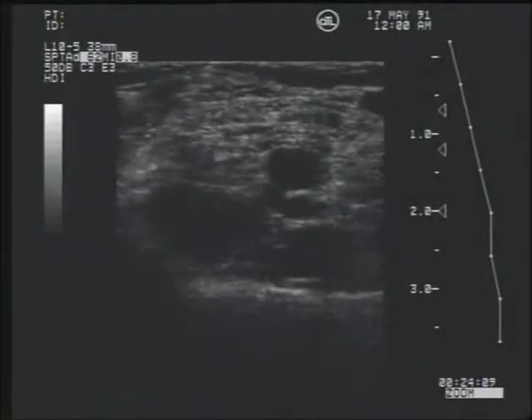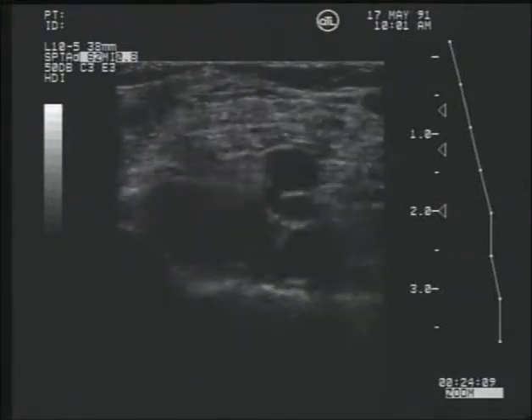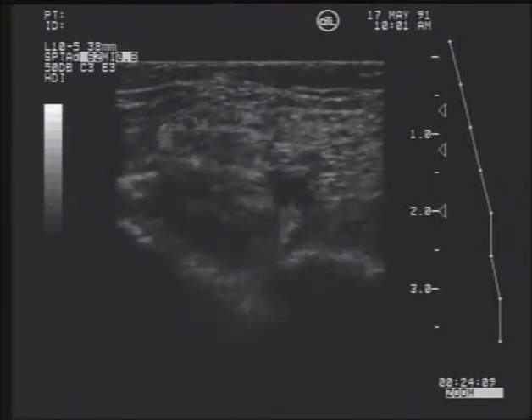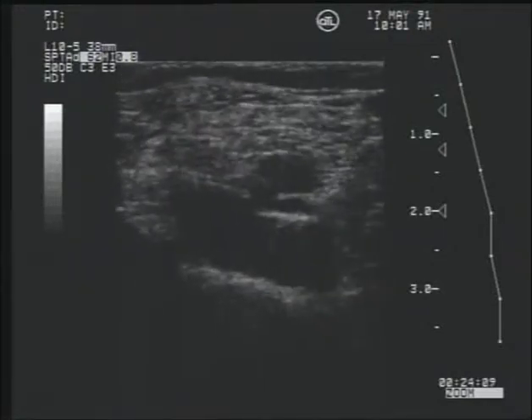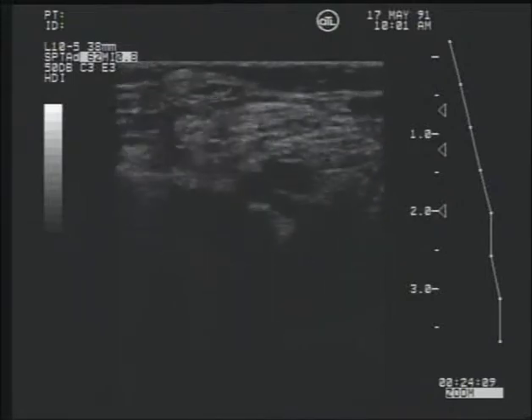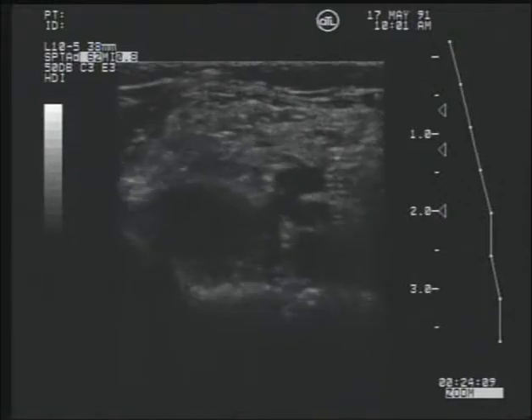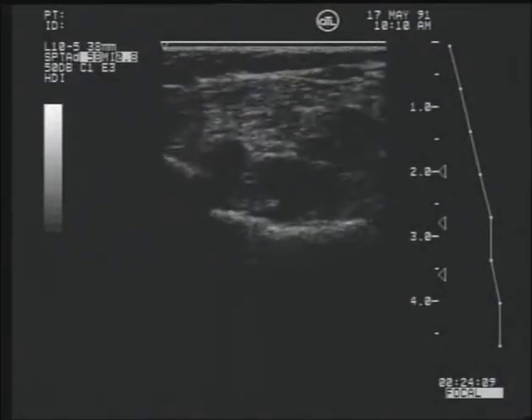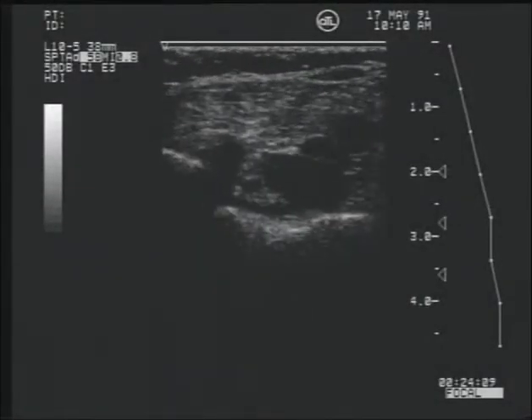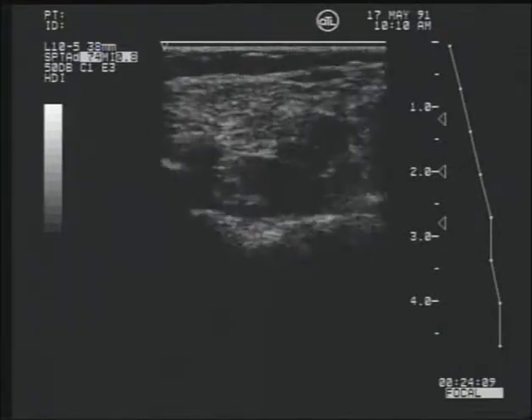When one encounters a large echolucent structure located near the popliteal vessels in the popliteal space, the presence of a Baker's cyst should be suspected. This is especially true when the patient gives a history of degenerative joint disease and sudden onset of pain behind the knee. A Baker's cyst, also commonly known as a popliteal cyst, is a collection of synovial fluid that has been displaced from the popliteal bursa and has formed a new sac posterior to the knee joint. They can be quite painful.